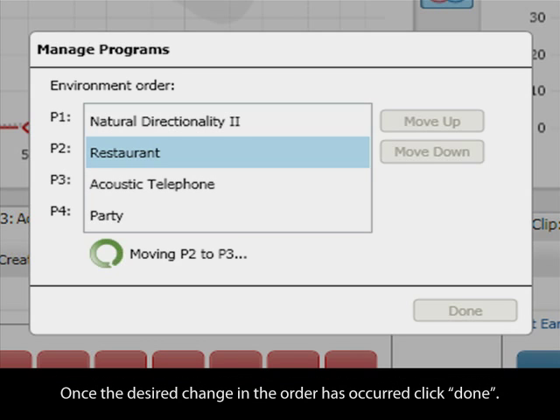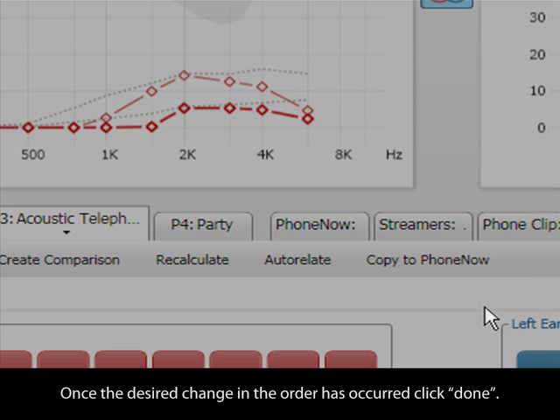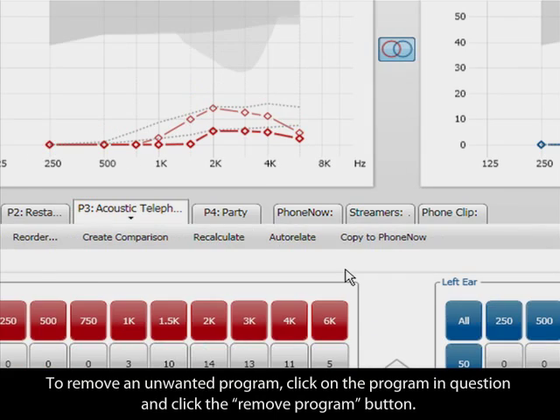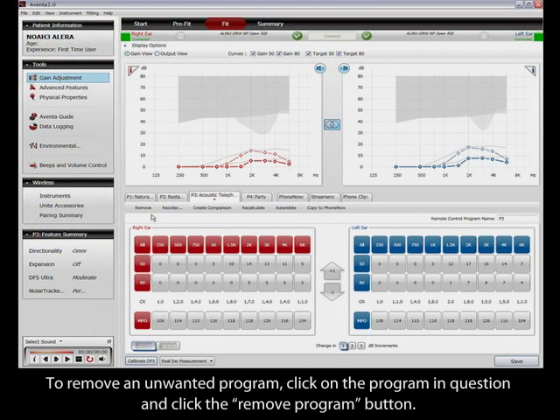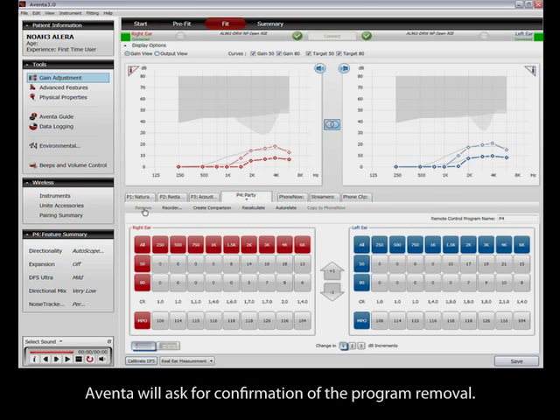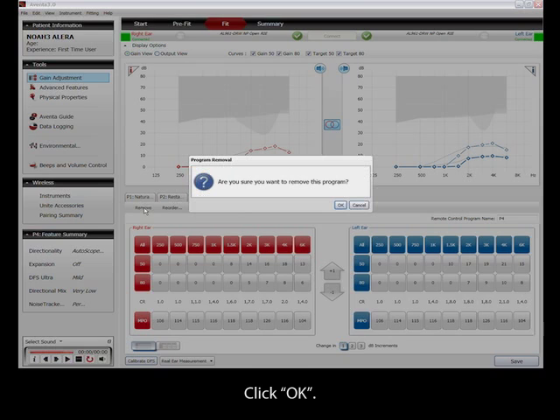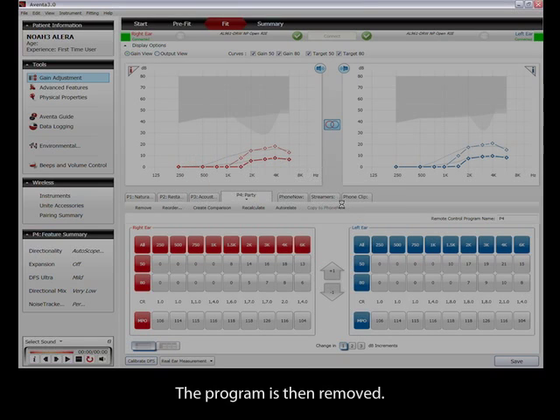Once the desired change in the order has occurred, click Done. To remove an unwanted program, click on the program in question and click the Remove Program button. Eventor will ask for confirmation of the program removal. Click OK. The program is then removed.